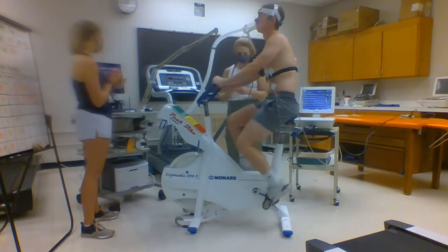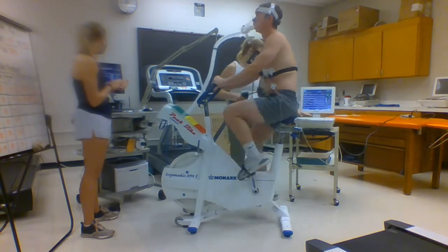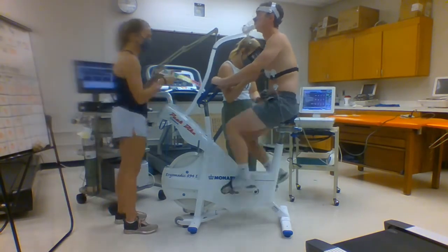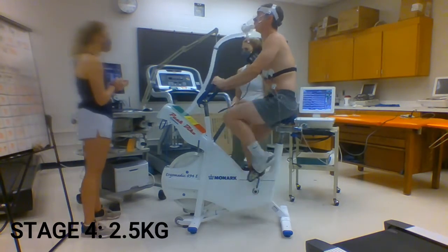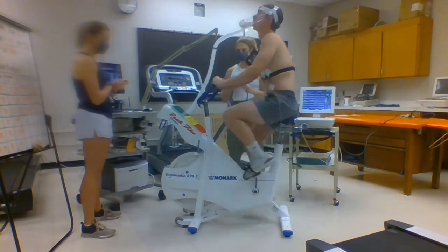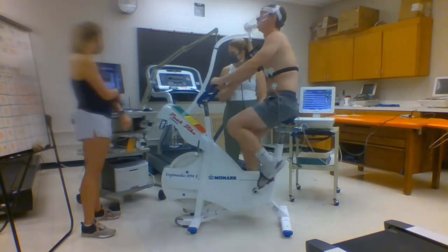At the end of each 2-minute stage, we will print the ECG tracing for the completed stage. In addition, the participant's heart rate, RER, and blood pressure will be recorded, and we will ask the participant their rate of perceived exertion, or RPE, on a Borg scale 6 to 20.